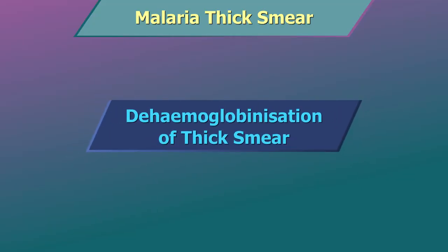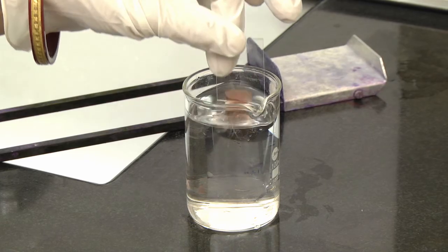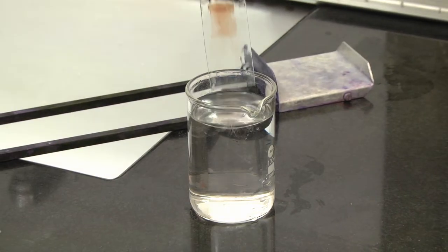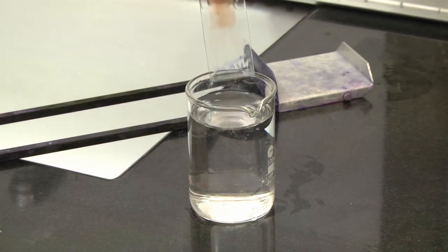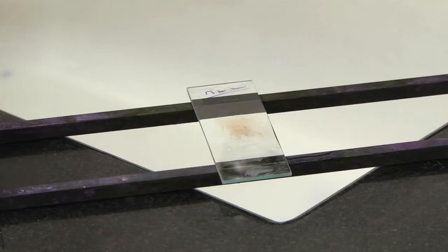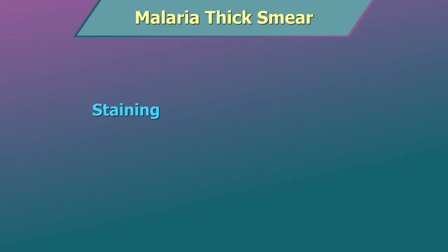De-hemoglobinization of thick smear: dip dried thick blood smears once into a beaker containing normal water and take out immediately. Care should be taken to not wash off the smear during the process. Do not touch or wipe the wet smear. Alternatively, keep the dried smears flat. When dried, the slide is ready for staining.